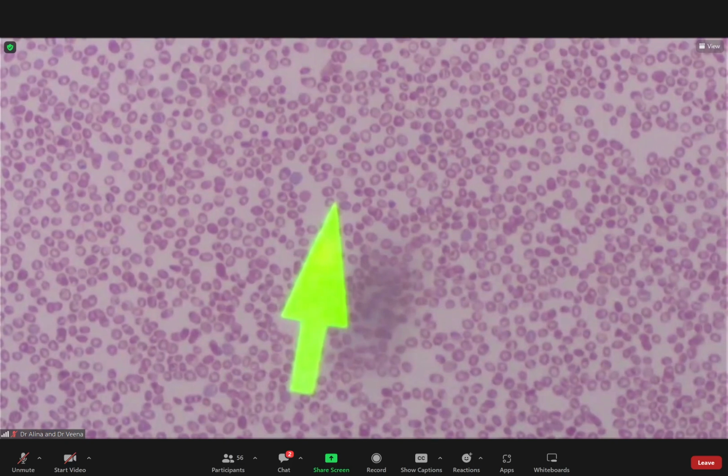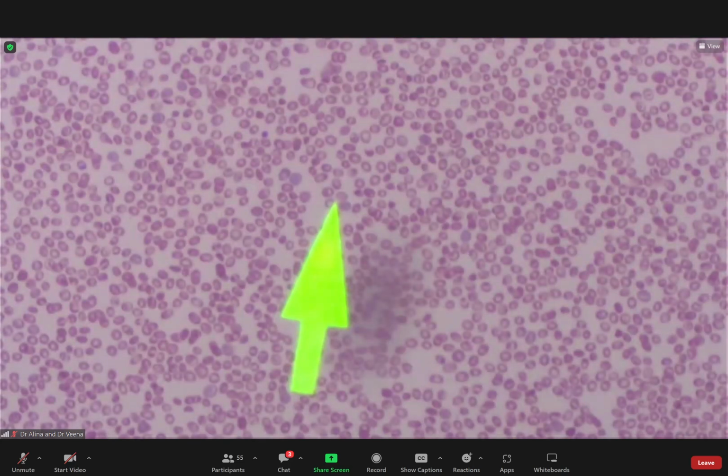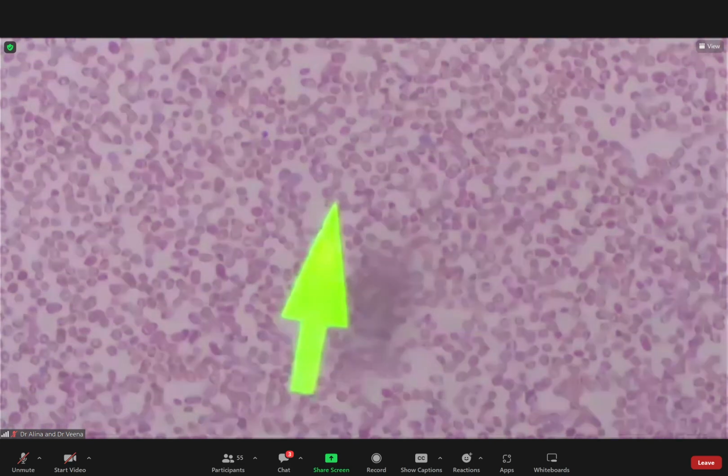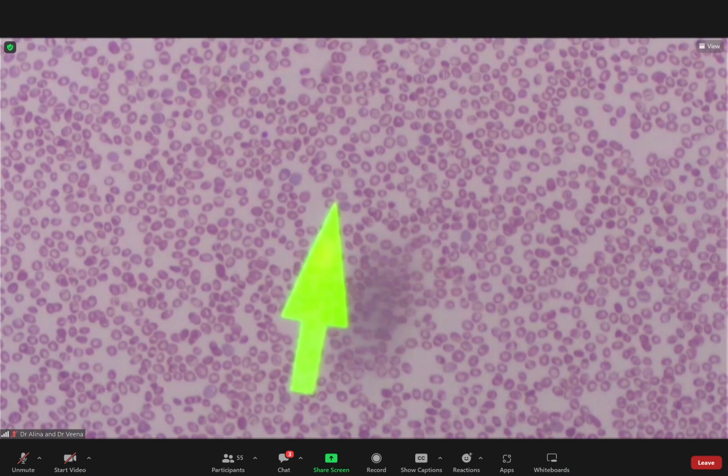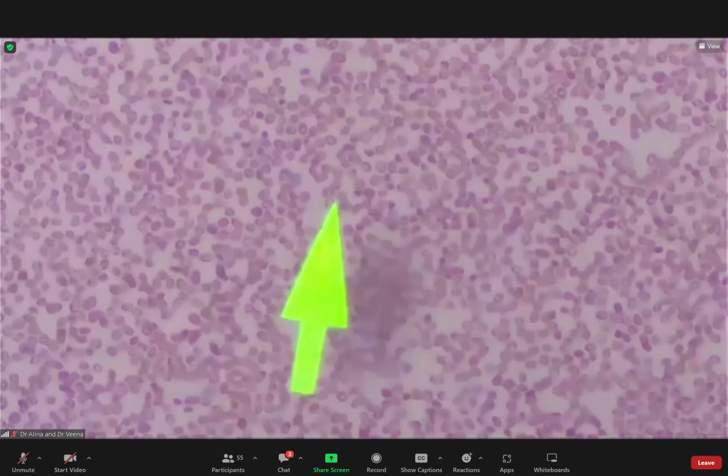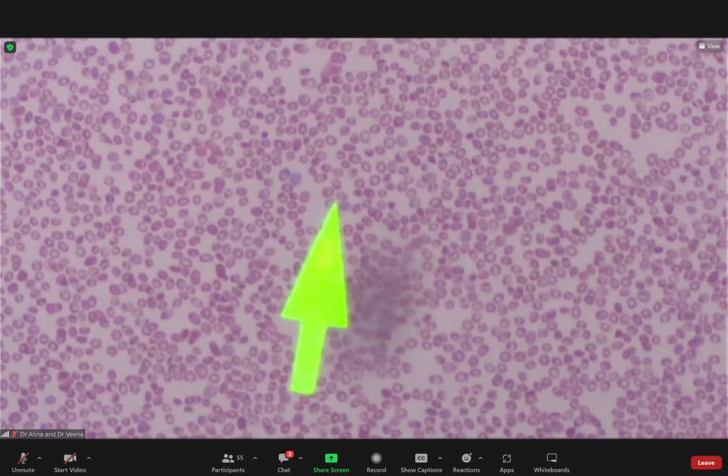So this is actually a red herring. I mean, you are looking for lymphoma cells, but don't ignore the more prominent findings, which are actually the red cell findings. Okay. So there's a question in the chat box asking why the question is to rule out relapse of lymphoma. Yeah, it's a bit of a trick question. Like Dr. Wirda said, it's a red herring. While we wanted you to look out for lymphoma, we actually wanted you to be able to detect that this patient has target cells with post-splenectomy changes. Okay?